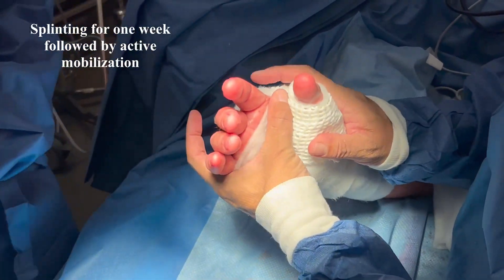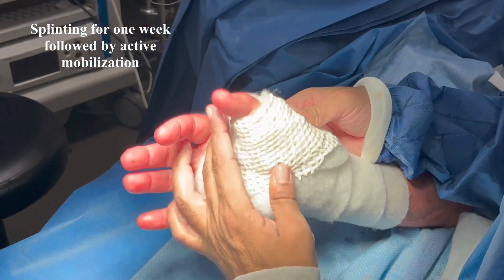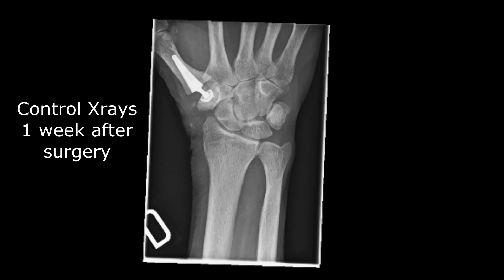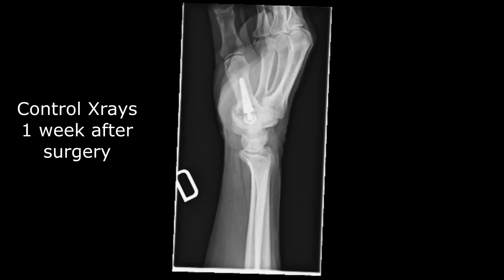A splint is applied for a week to control for pain and swelling. X-rays are necessary to check the position of the implant.